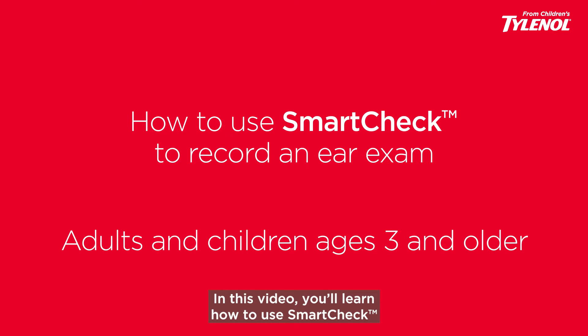In this video, you'll learn how to use SmartCheck to record an ear exam on adults and children ages 3 and older.